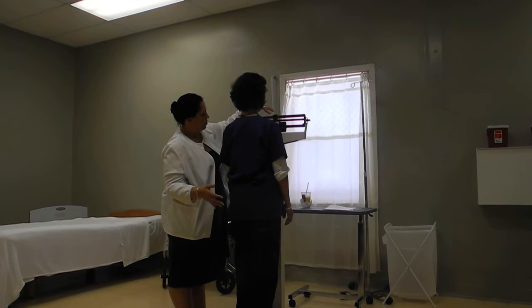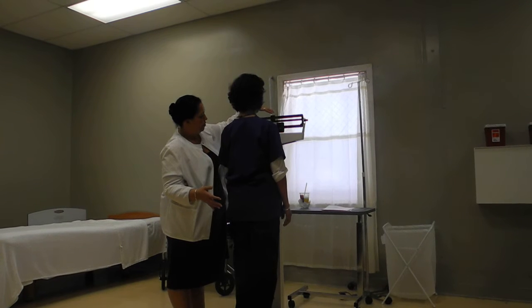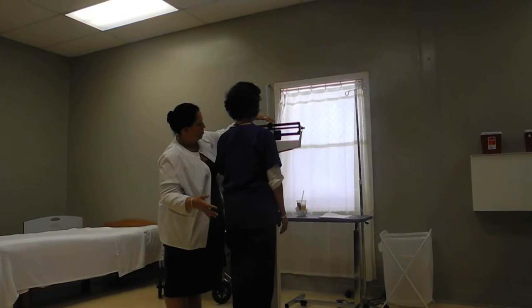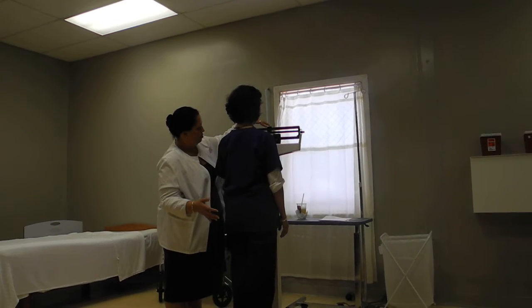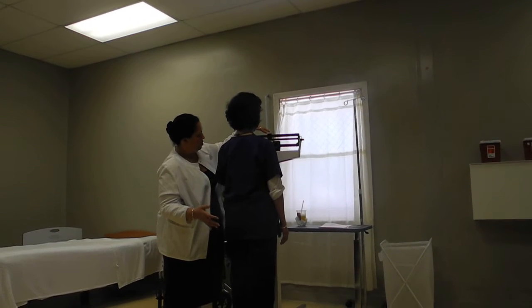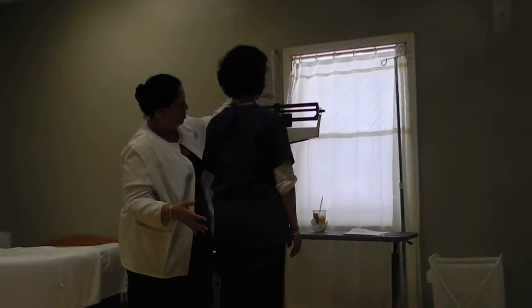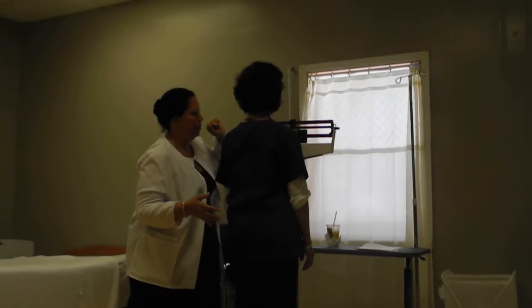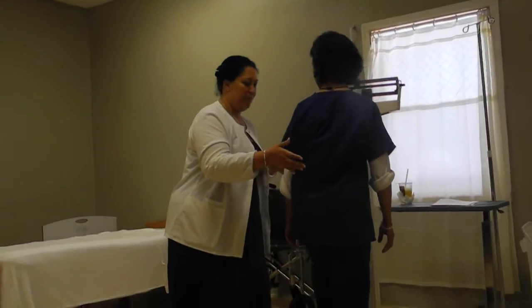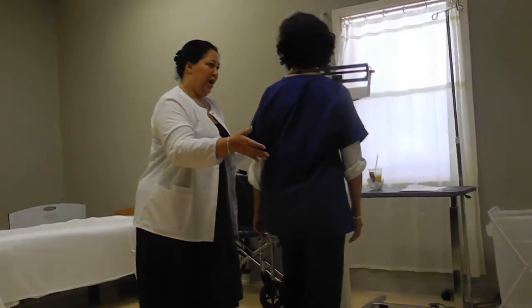Lightly. Number 124 rounding. Okay, so you get... Are you allowed to tell the patient their weight? Yes. Okay. You can, if they ask you.